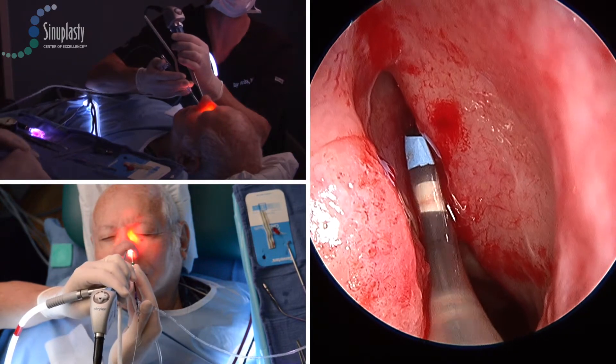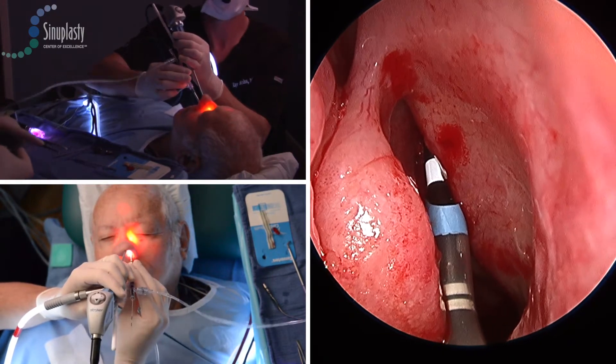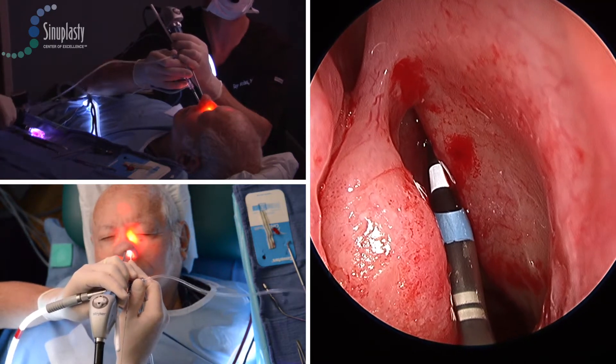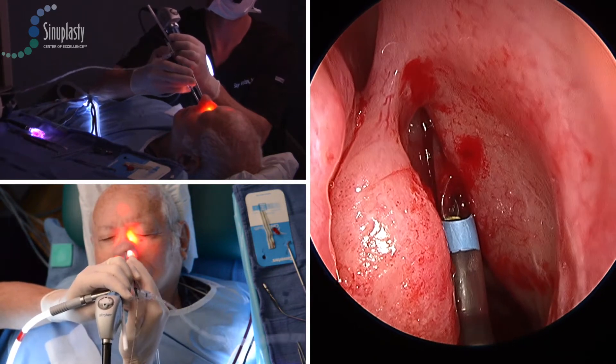The balloon catheter will commonly carry a part of the wire with it, and that can be uncomfortable in an in-office setting, so you can see that the wire was slightly retracted. That's where you saw the illumination move, and now we're going to dilate three times fully, hitting each part of the outflow track.